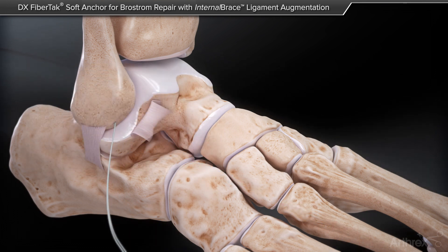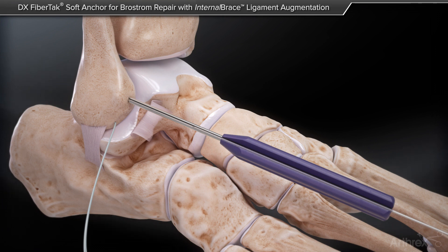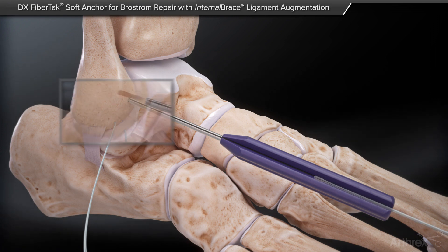This process is repeated for the second anchor in the Brostrom repair construct. The second anchor should be placed about 2 cm from the distal tip of the fibula.